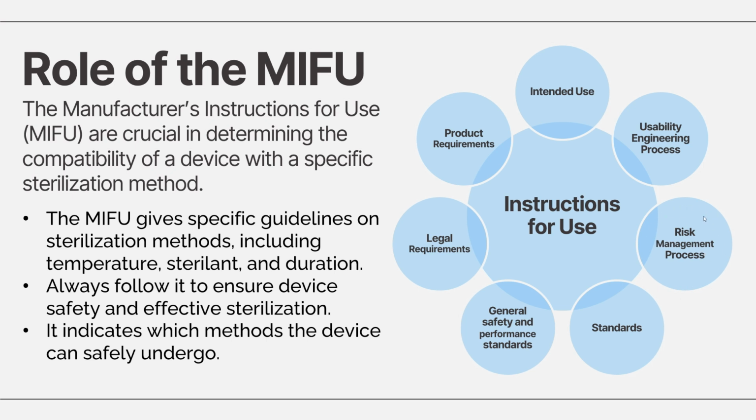Incorporating risk management, the MIFU identifies potential hazards and outlines steps to reduce risks to both users and devices. It ensures compliance with industry standards, regulatory requirements, and safety expectations. Additionally, the MIFU confirms that the device will perform safely after sterilization and includes legal and technical details specific to the product. That's why it's important to always consult and follow the MIFU to ensure effective and compliant sterilization.